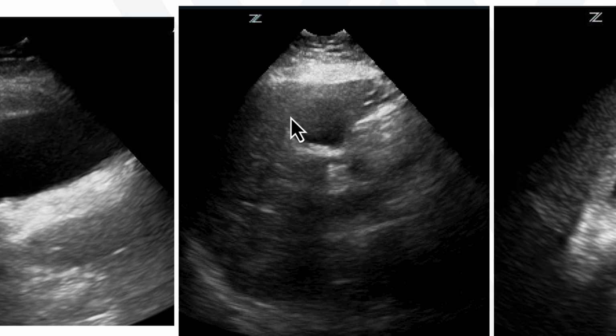Here in this transverse view, we see the gallbladder, the black fluid-filled structure, and we see three little stones and these subtle little shadows coming down from this gallbladder. So pay attention to a smooth posterior or dependent wall, and if it loses smoothness or looks rough, then get a closer eye on that. That may be a sign of some stones.